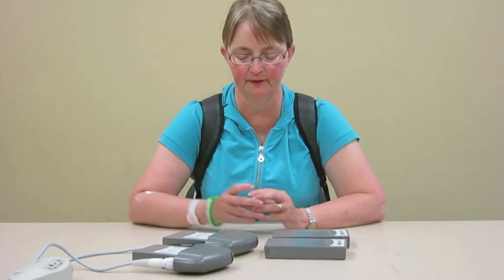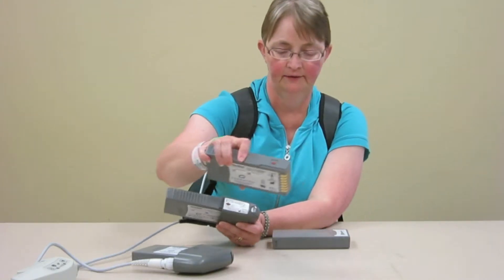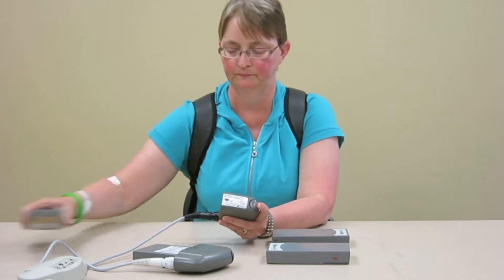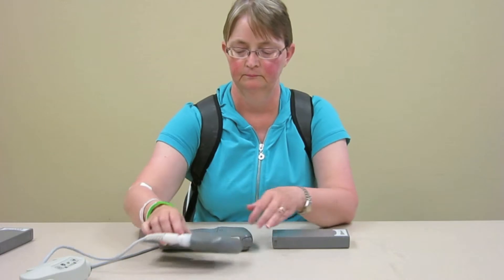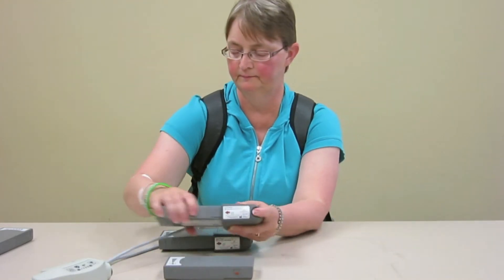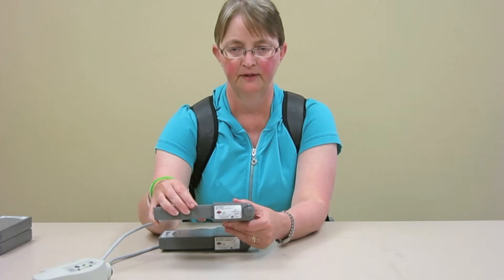If your batteries are spent and you need to replace them because you still need battery power, you need to take the orange arrow and the orange arrow on the battery and the clip need to match. Same with the other one — orange arrow to orange arrow — and you're ready to go.